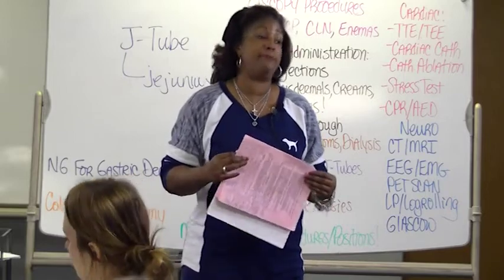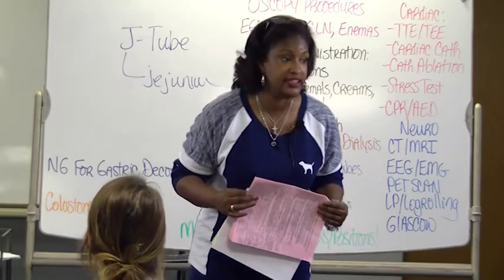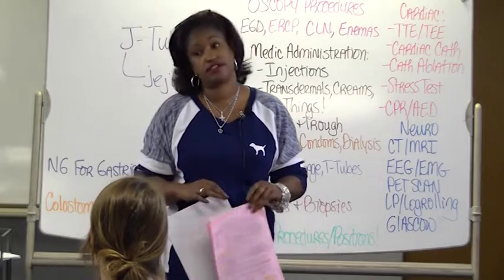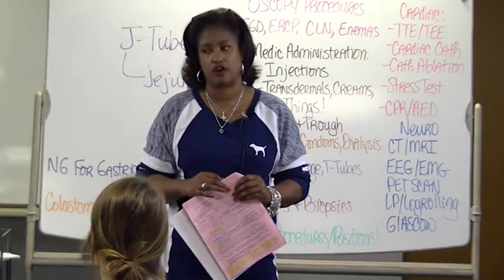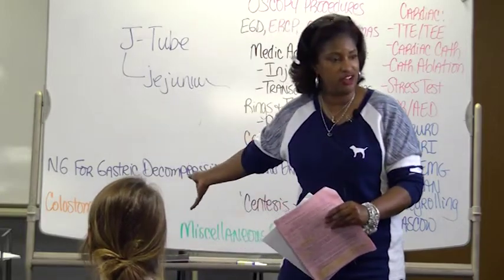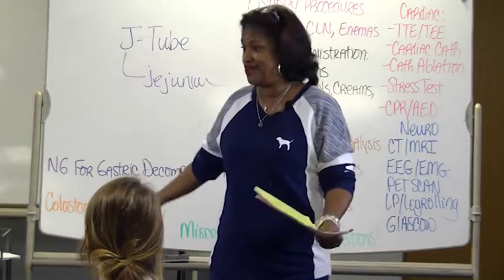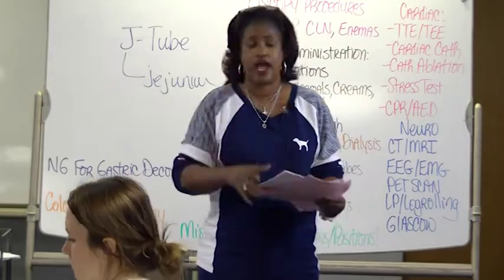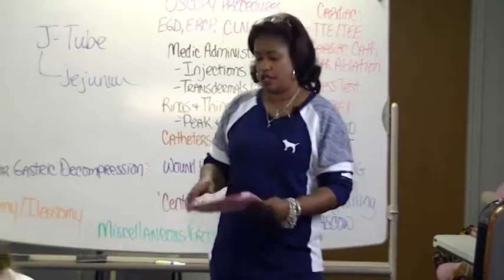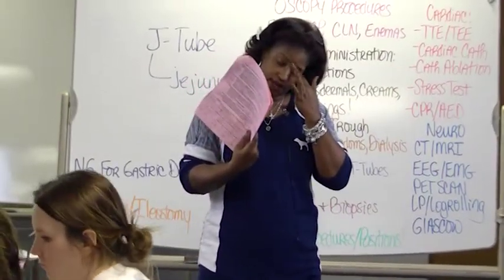A whole lot of people. But your resident started in July, and this is July 2nd. Think that way. Julys are awful. Your resident doesn't know anything in July. He just started. He's going to write NG for gastric decompression, because that's what we do on all brain injuries. We do gastric decompression. Don't get it twisted. We still got to do it. We just don't need to go through the nose. Now, that's my next point. Gastric decompression. If you look at the pink, you can see I have a whole section on it.